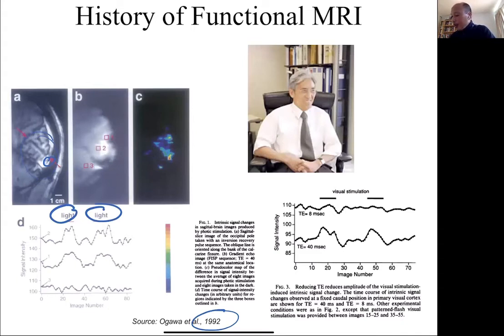on and off. And one key thing to realize is we've been talking a lot about TEs. Here they use an echo time of 40 milliseconds. You can sort of see a fairly nice, robust response.